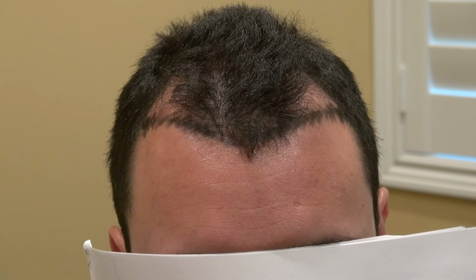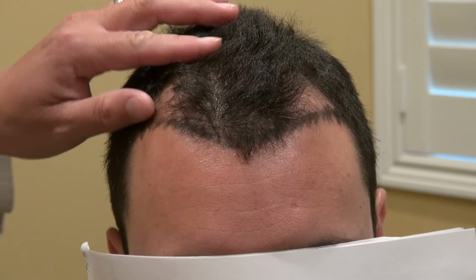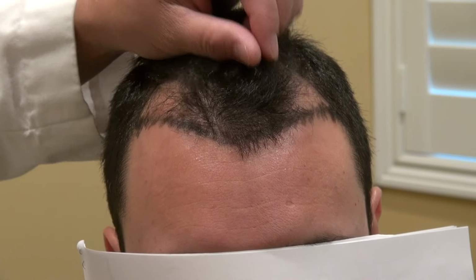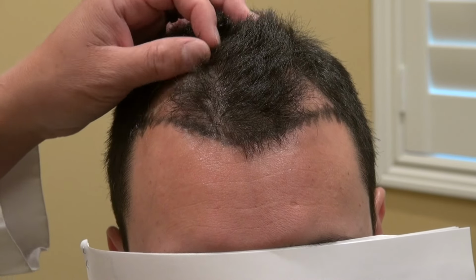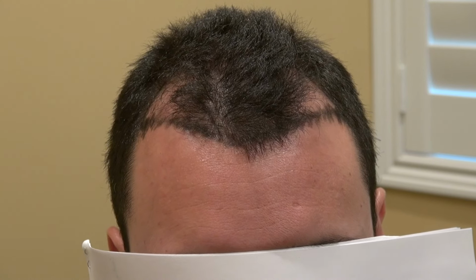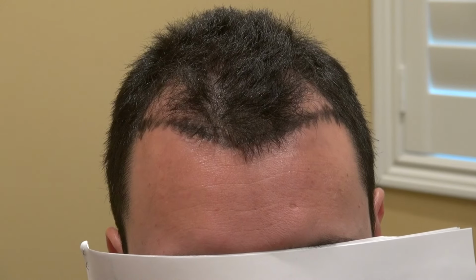And then selection of hair graft is important. We try to plant rows and rows of single hair grafts in the front, followed by grafts that grow 2 hairs, 3 hairs, and 4 hairs in the back for bulk and volume. And the other important factor, we're going to attempt around 1,300 to 1,500, somewhere around there. We not only fill in both corners, but we do some reinforcement as well.